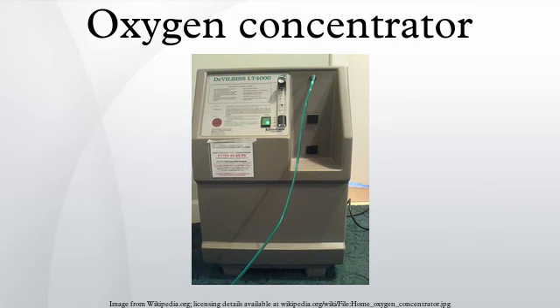The pressure in the hose delivering oxygen from the equalizing reservoir is kept steady by a pressure-reducing valve. Older units cycled with a period of about 20 seconds, and supplied up to 5 liters per minute of 90+% oxygen. Since about 1999, units capable of supplying up to 10 lpm have been available.